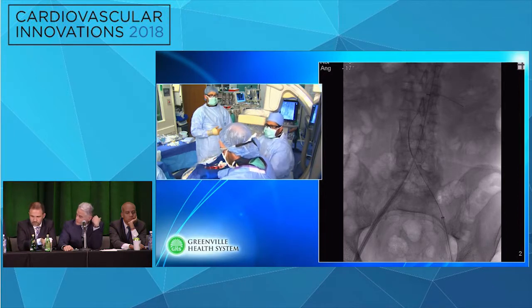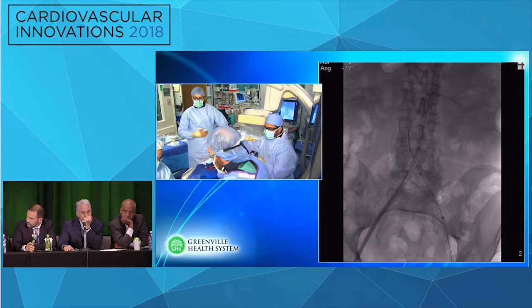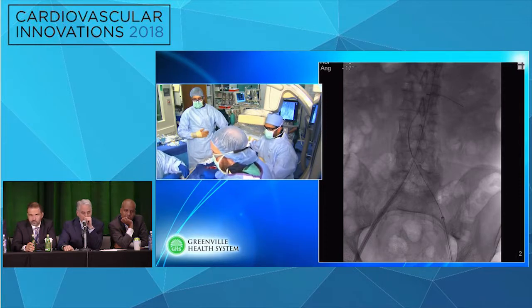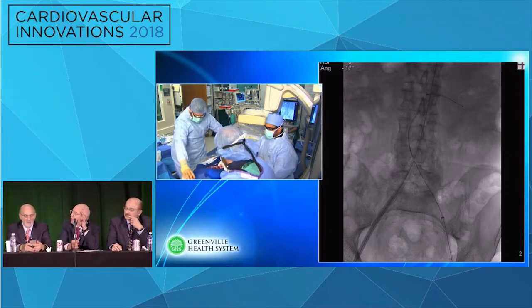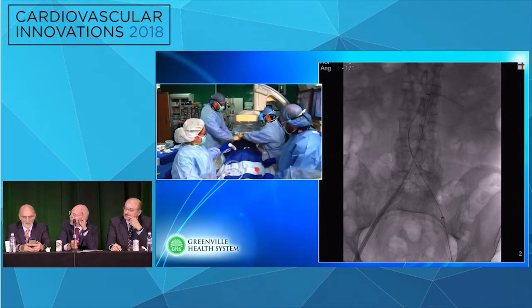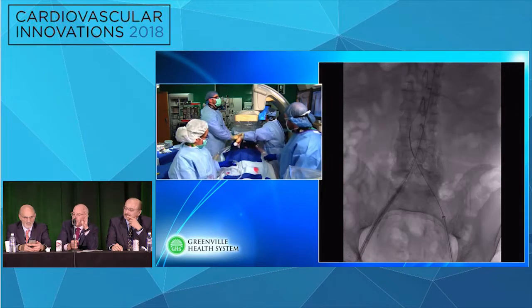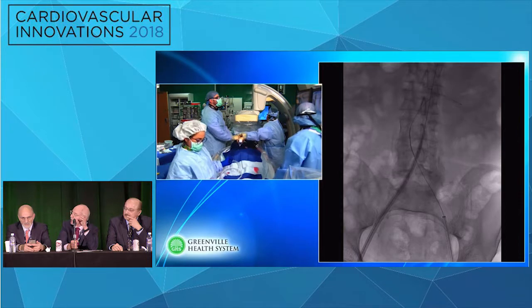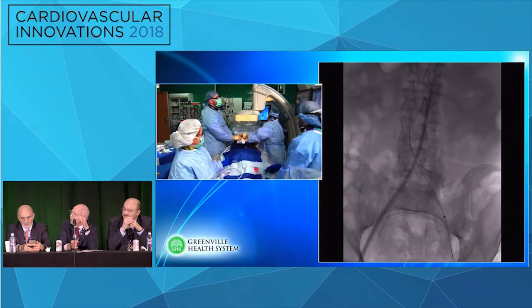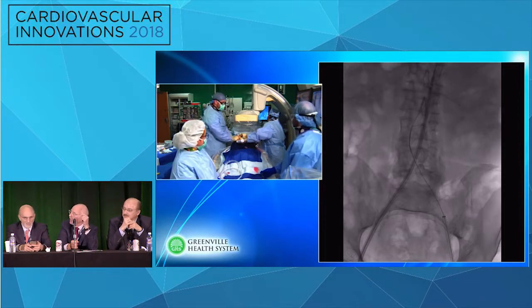So we use IVUS at our institution for all of our endografts, and it's been very helpful both in sizing as well as reducing the amount of contrast exposure that we have. It's probably the best way to determine that you're intraluminal when you cannulate the contralateral gate. And there are a few times where we do adjust the size of the device that we choose based on the IVUS. Although we do all of our measurements off CT originally, now, of course, in the old days CT wasn't very good. Now we have multi-slice scanners that are so much better, and TeraRecon and so on. But we still often double check, so it's sort of a belt and suspenders thing. So every once in a while we'll find one that we're concerned about infolding, that we've gone too big, or that perhaps we've undersized based on the CT. So we find it very helpful.